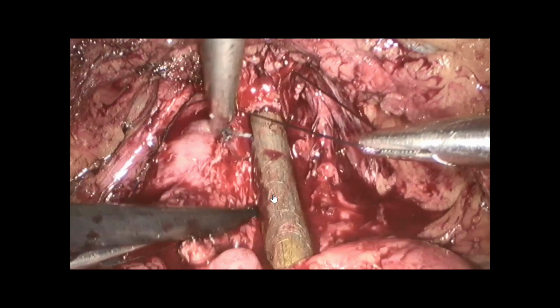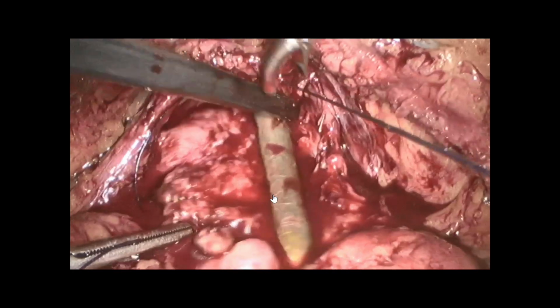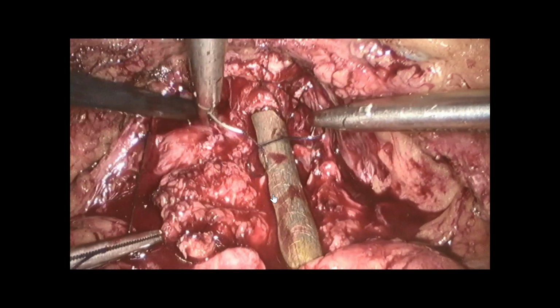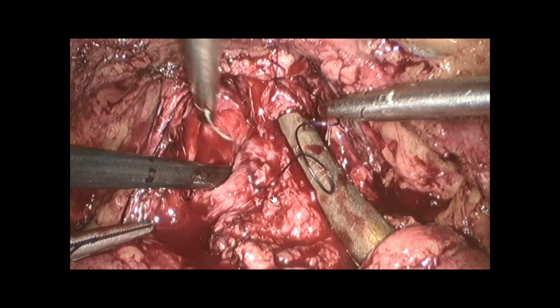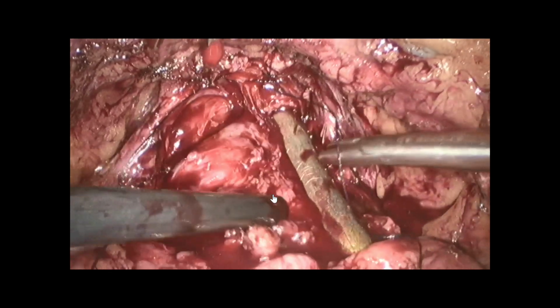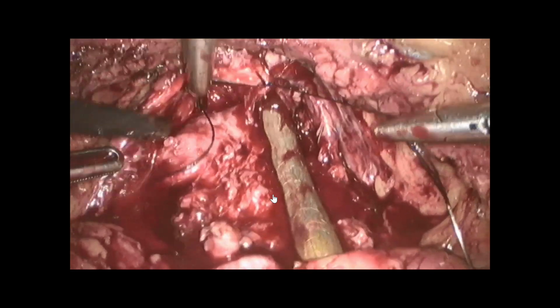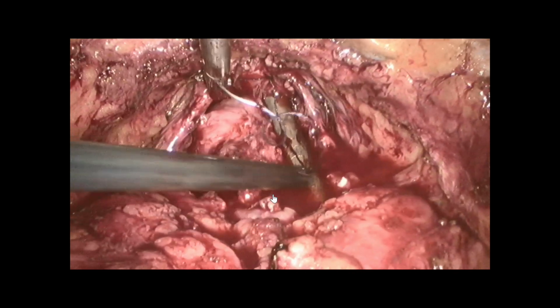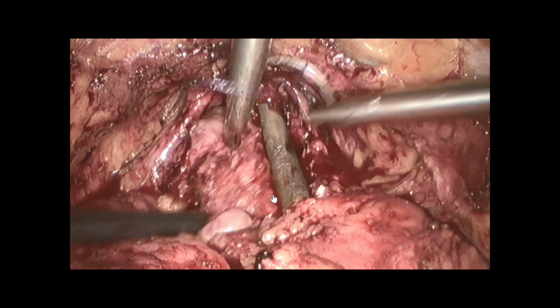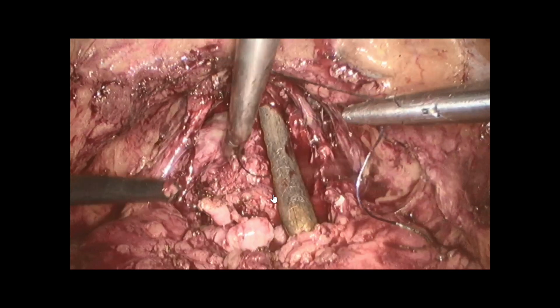And you see I'm working with 2 needle holders. That's my habit. You will do what you prefer. Personally, I like to have 2 needle holders because I like to work with both hands. So when it's done, I will tie it and I will fix it anteriorly to the pubic bones. You will see this part will be going up, and that means that it will be fixed.